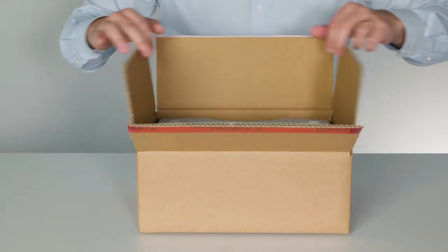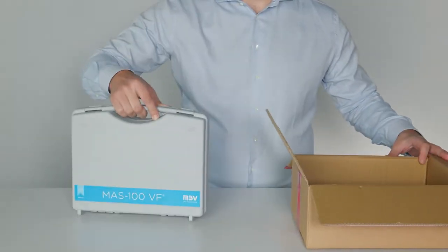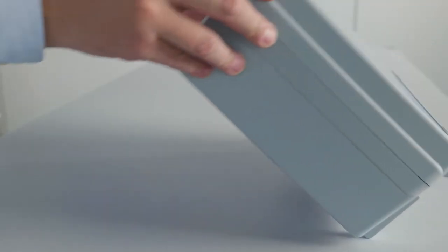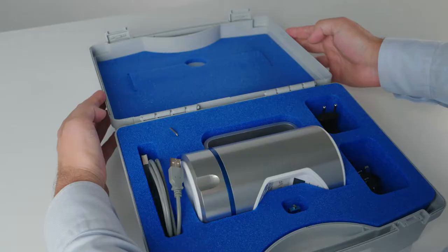The MAS-100 VF is delivered in this compact box. Inside is a sturdy transportation case. It is ideal for sending your air sampler to a calibration center. Now let's see what's delivered with the MAS-100 VF.